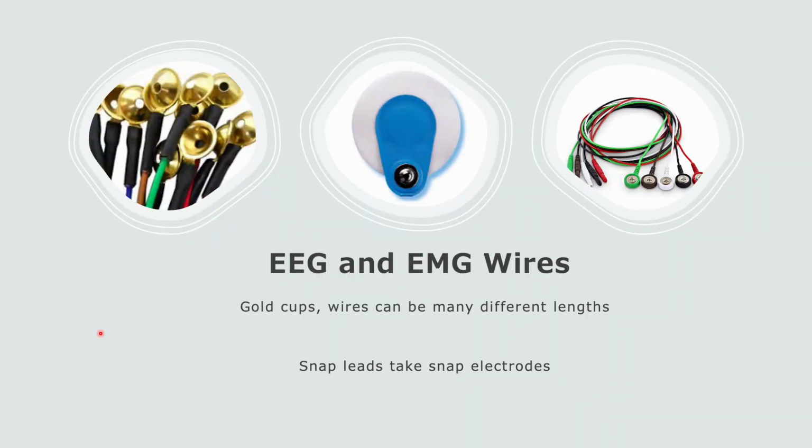EEG gold cups, which are these, the gold cups, and then the EMG snap leads, which are these, and they hook into these little guys right there. That's why they're snap leads. EEG wires are used for all the 10-20 locations, both mastoids, the EOG and the chin EMG. If they're long enough, they can be used for the EKG signal and the limb EMG signals.